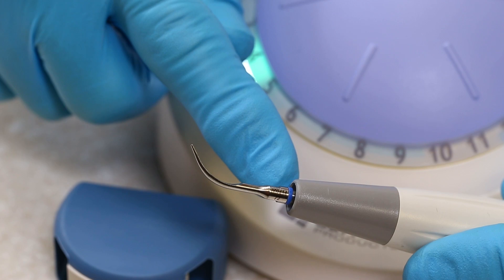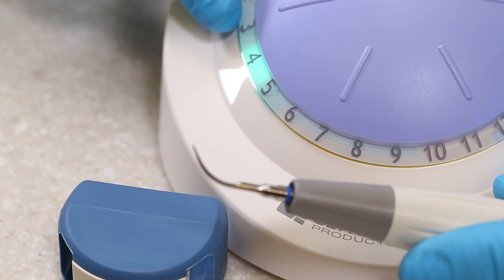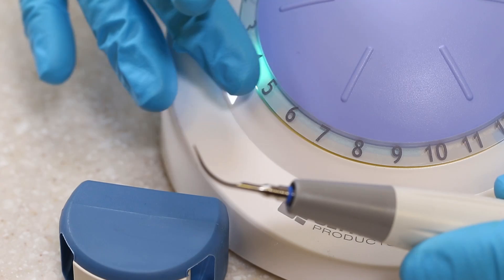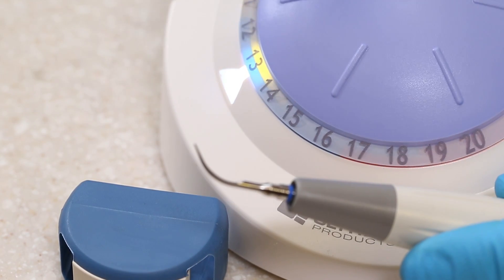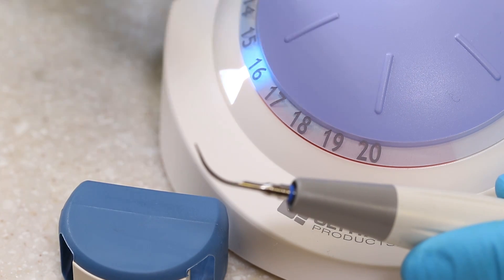If the tip is tight, check to see if your power is set too low. The Ultrawave uses the color coding system to ensure that the proper power is used with the proper tip. Make sure that the color of the tip and the colors shown on the dial match.